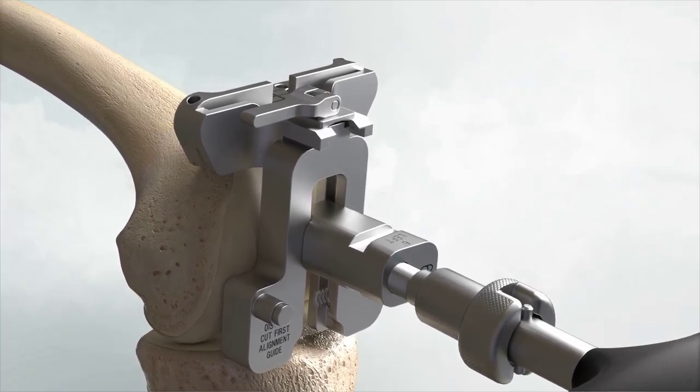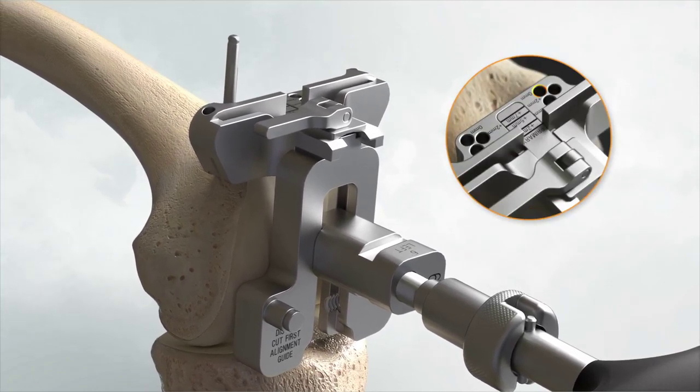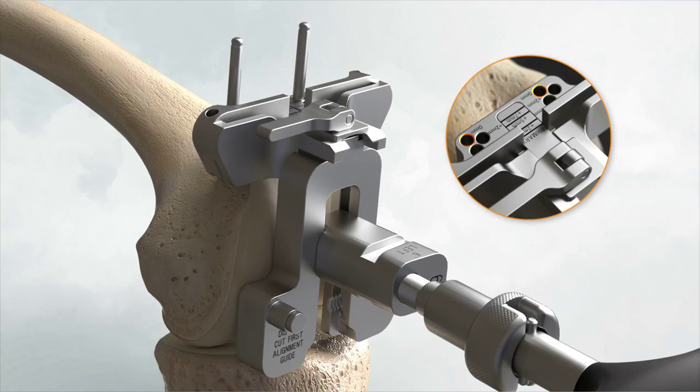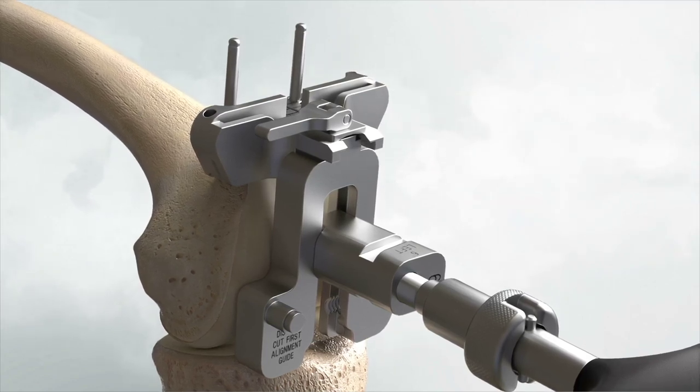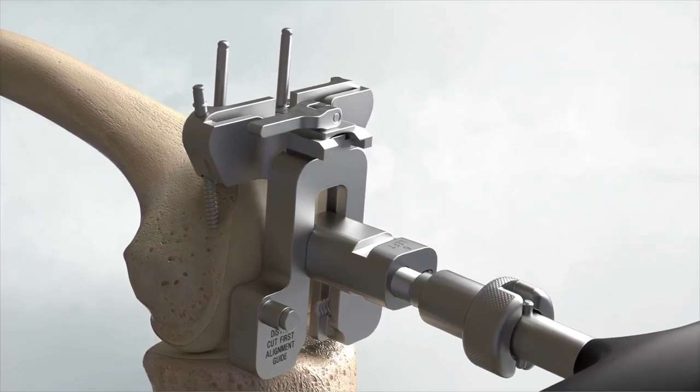Using non-headed speed pins, pin the distal femoral cutting block to the anterior femur using the holes marked zero. Once adequate distal femoral resection is noted, an additional headed or non-headed speed pin should be placed obliquely to provide additional stability.